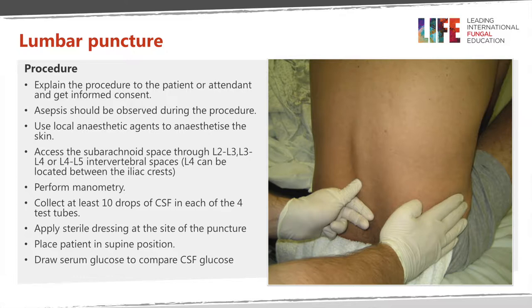We can go as high as L2 or L3 if that's the easiest space to palpate, however no higher, because of the risk of damage to the spinal cord. After introducing local anaesthetic, we slowly introduce the lumbar puncture needle, feeling a slight give as we pass through the ligament, and slowly remove the stylet until we have a clear flow of cerebrospinal fluid. At this point we add the manometer using a three-way stopcock, allowing the fluid to gradually rise. Don't read the measurement until the fluid has completely stopped rising — this gives you your opening pressure, measured in centimetres of H2O.